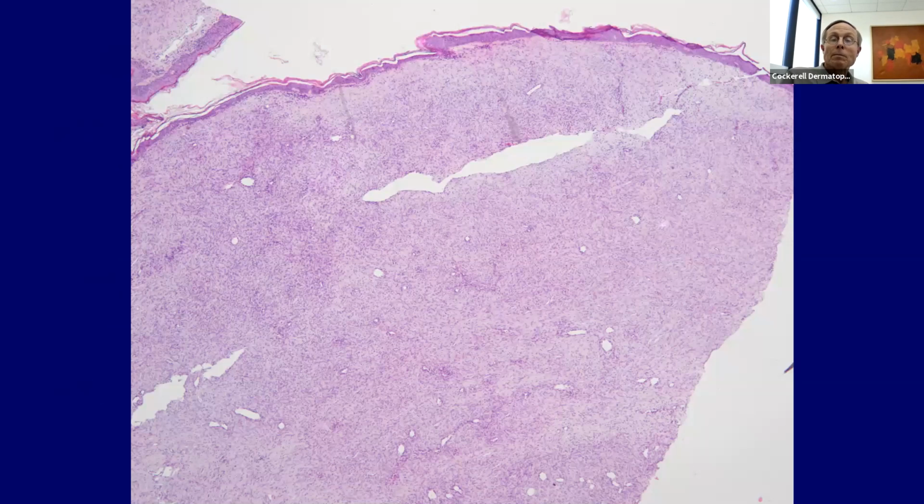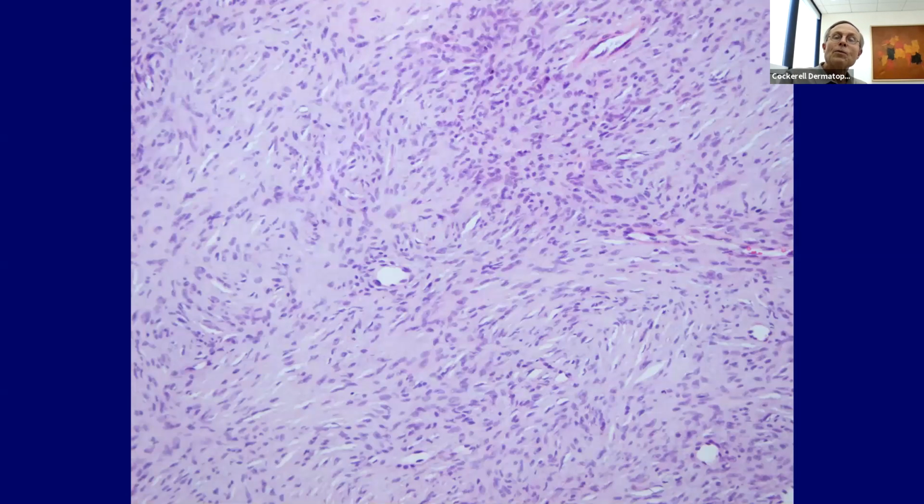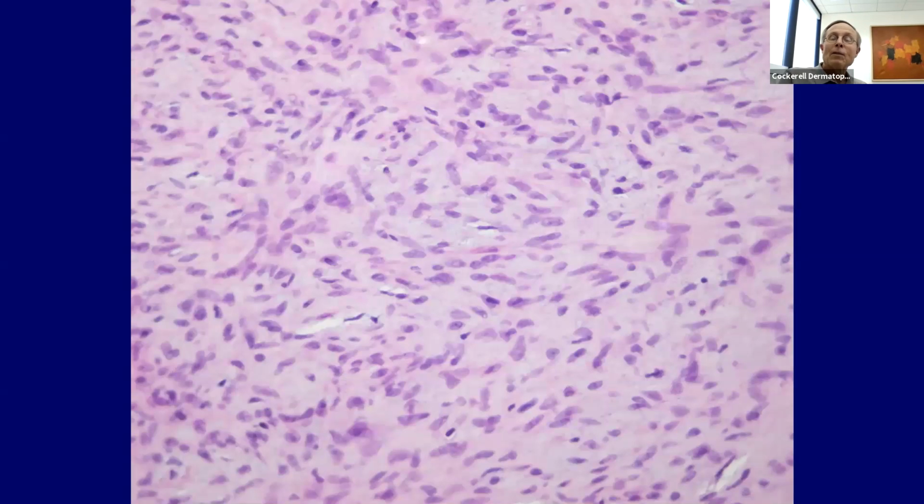Last question. Okay, we've got a deep incisional biopsy. It's a spindle cell proliferation. Okay, this should be review for you, hopefully. We've already talked about spindle cell neoplasms several times this year. And the cells are arranged in fascicles that interweave. So for those of you that like to get the right answer, it's dermatofibrosarcoma protuberans. Okay, so we throw that on there, expected to get it pretty quick.